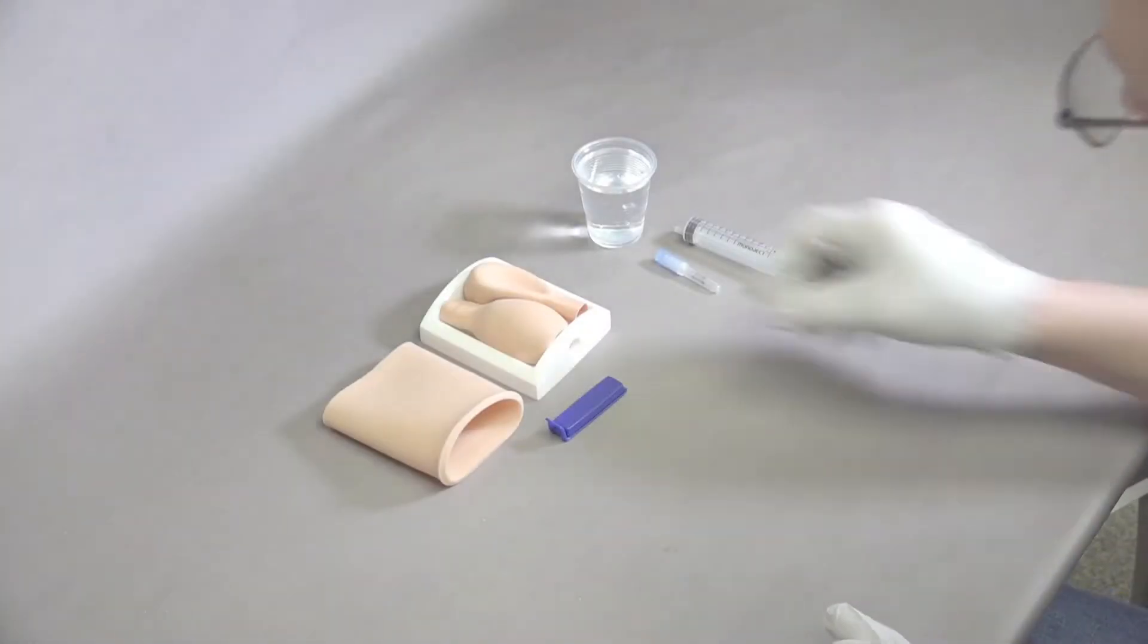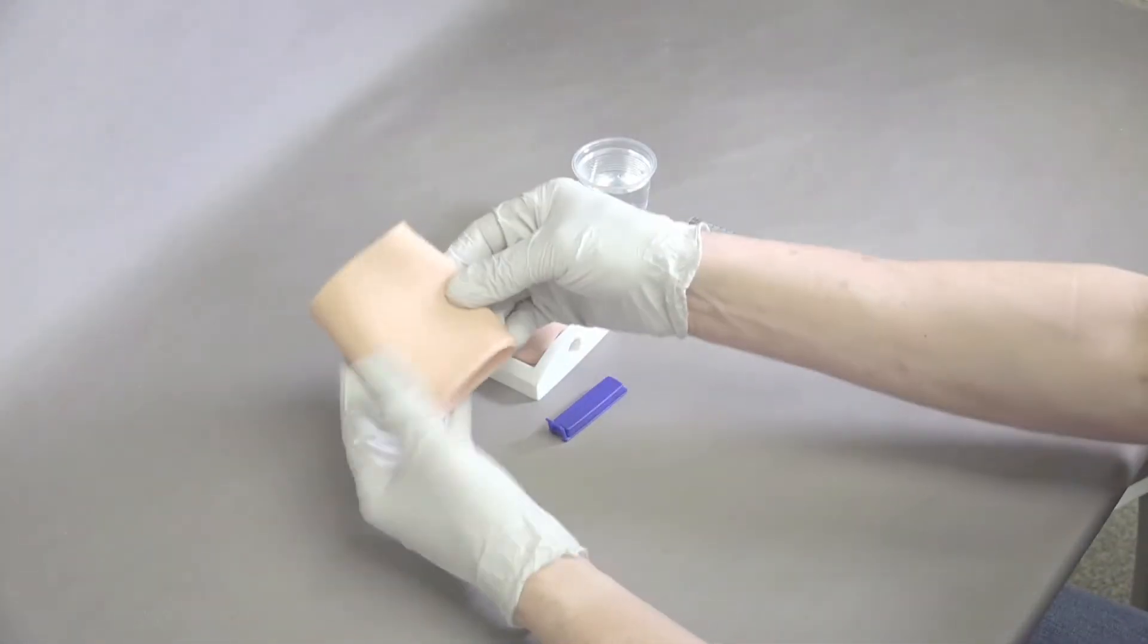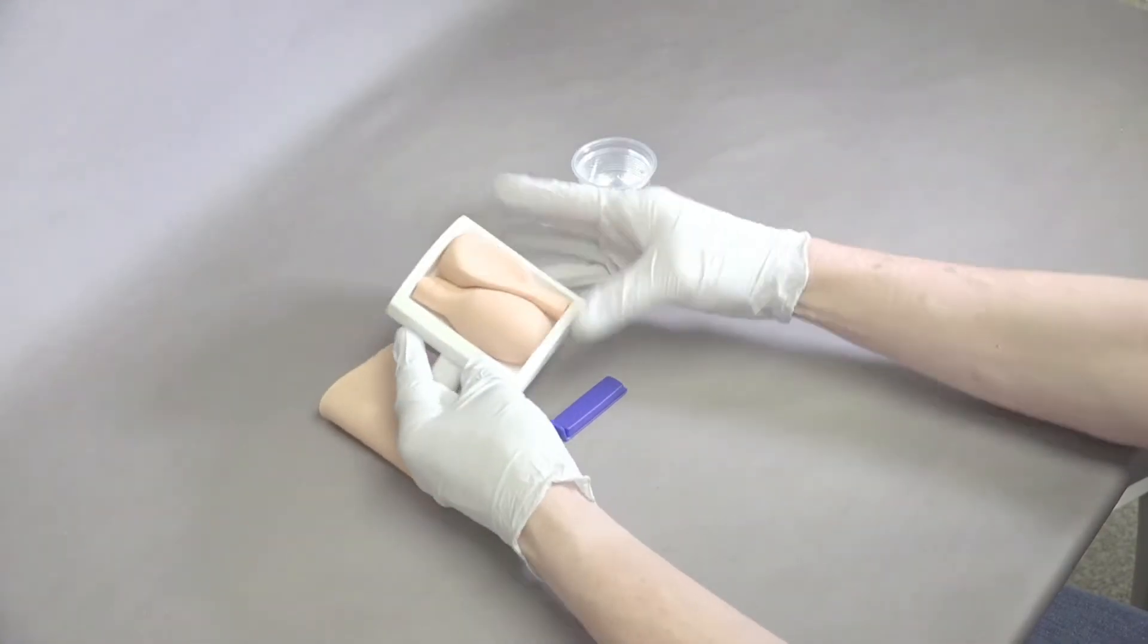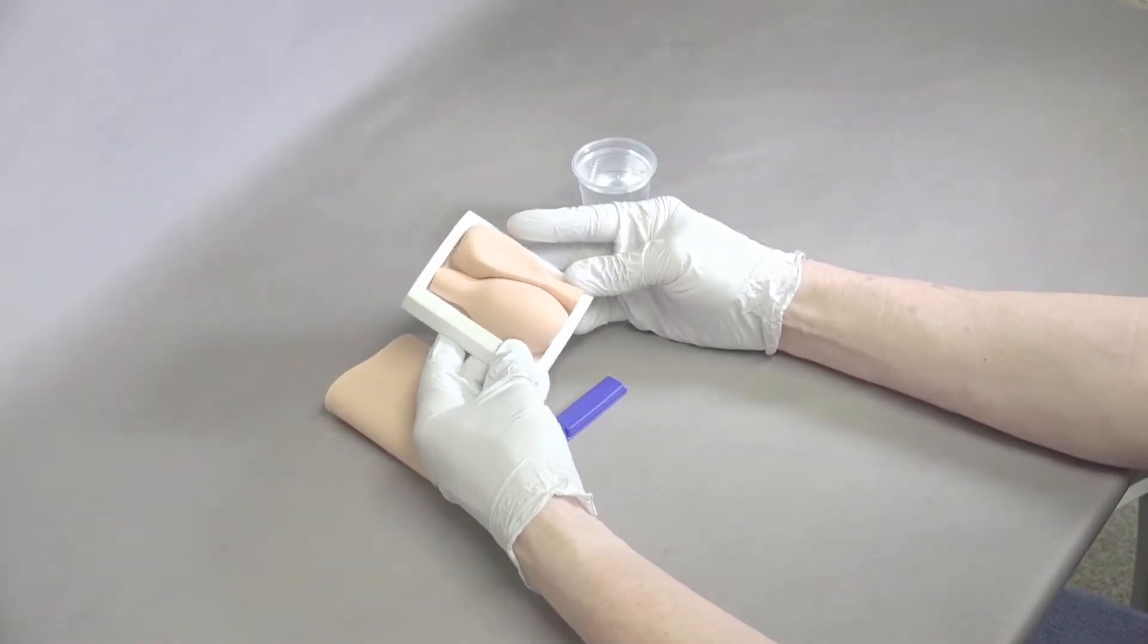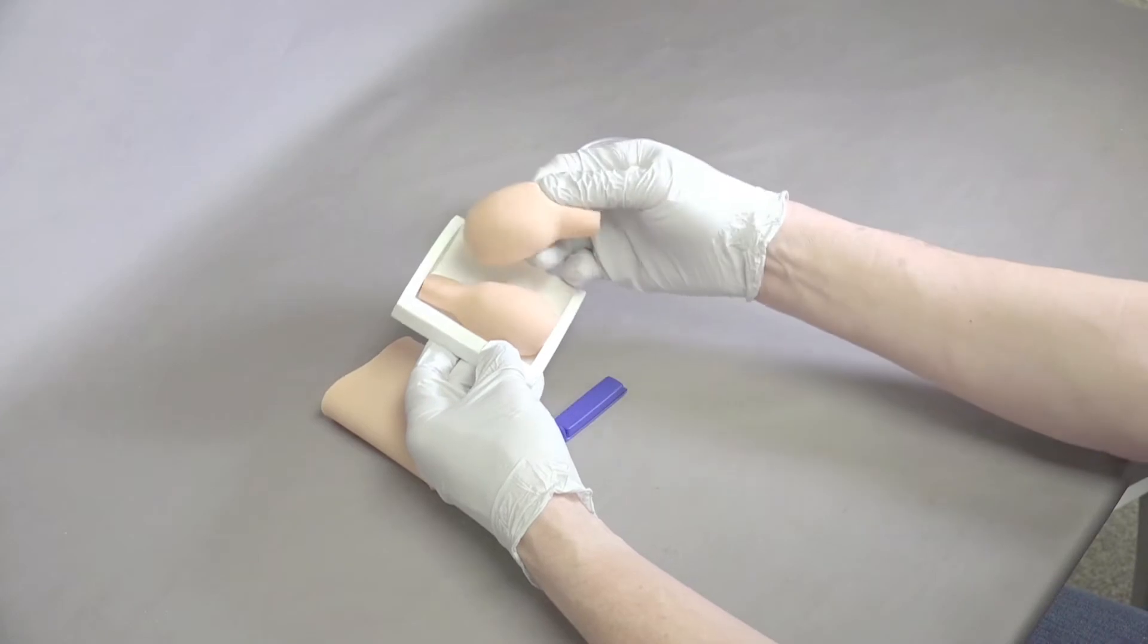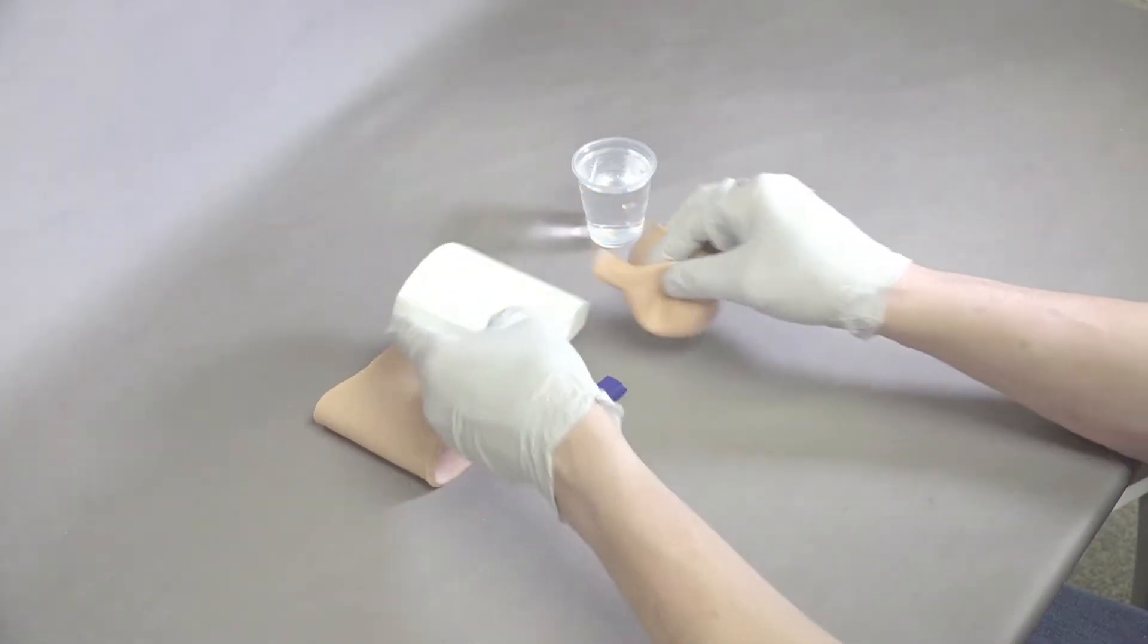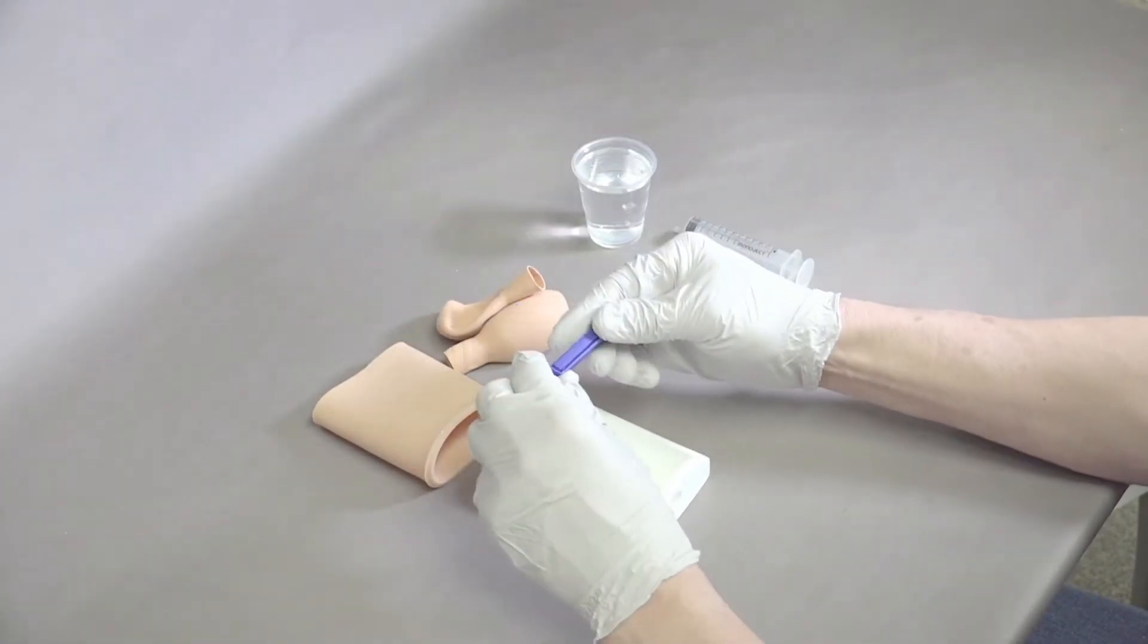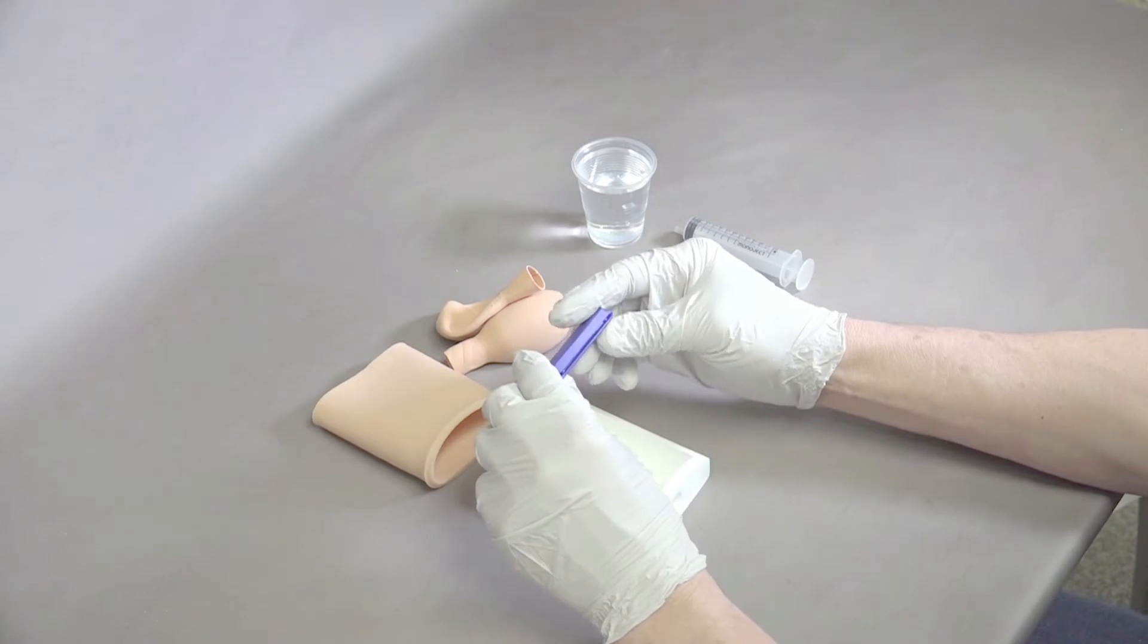This cystocentesis model comes with a skin that goes over the top, a plastic sleeve or reservoir, two bladders, and a clip that will keep the fluid in the bladder.